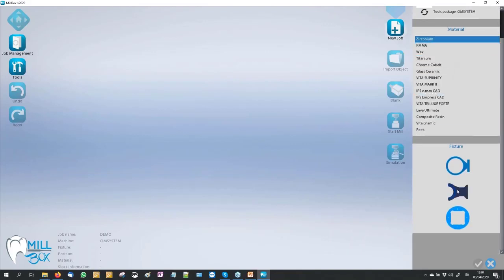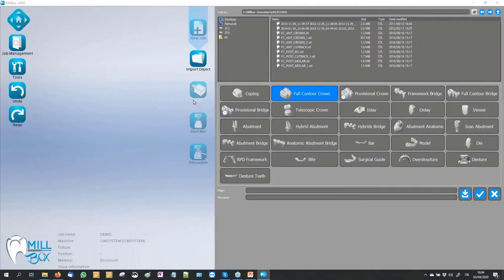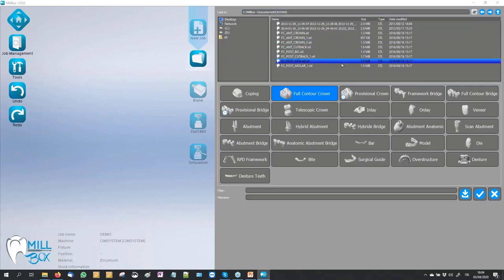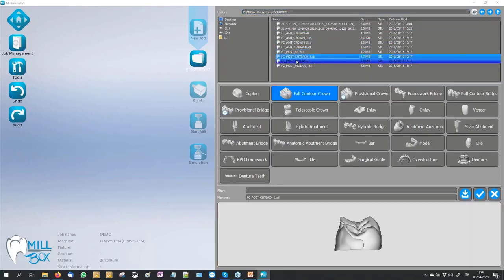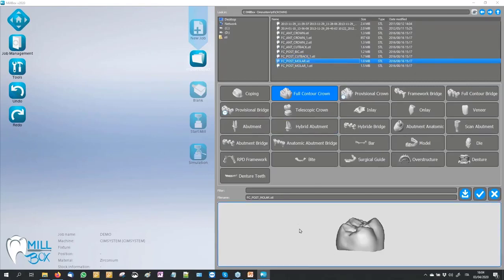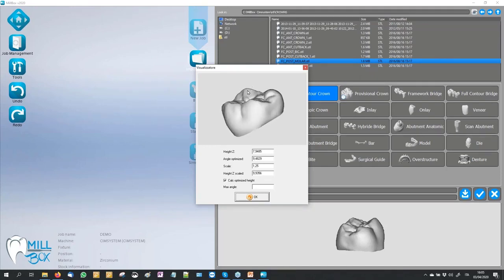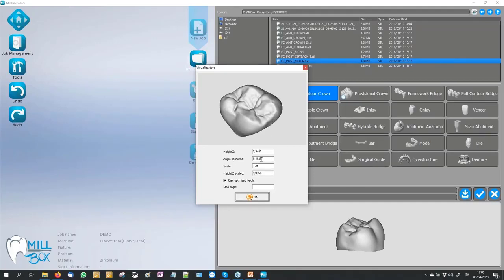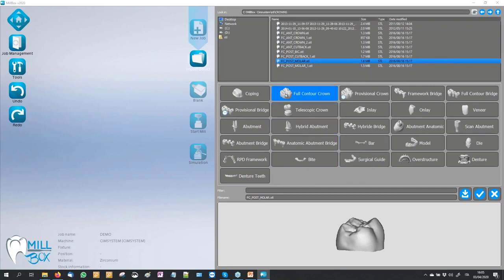We come back to our zirconium material and we can start also with the open holder. The software goes directly inside the folder where we store all our STL. Clicking on one STL, the software directly shows us the shape of the STL in a 2D preview, and we have much information about our STL in order to understand which is the right dimension of our stock. One important thing is to select the right type of object, because a different type of object needs different points of reference, and this selection gives the command to the software to create the right point of reference.